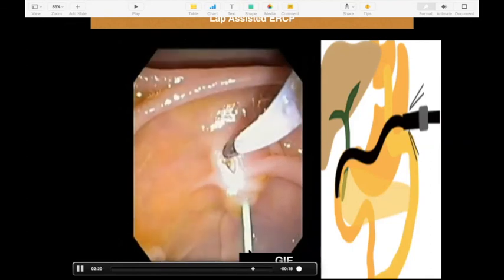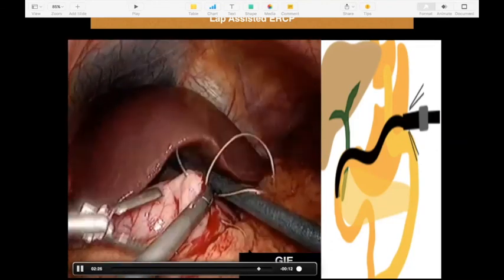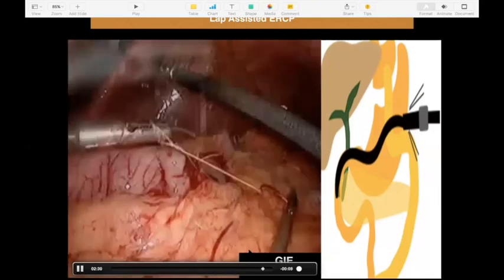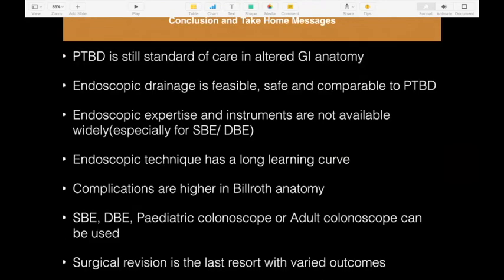I've done two cases like this because we don't have Axios. If we use Axios for the upcoming procedure, the cost of the procedure will become very high, and that is one of the issues which we feel.